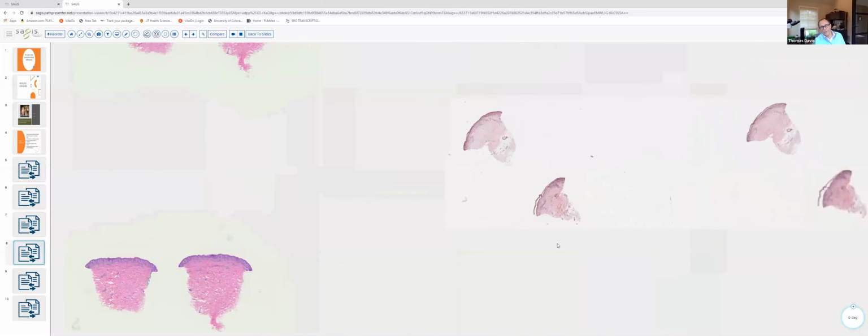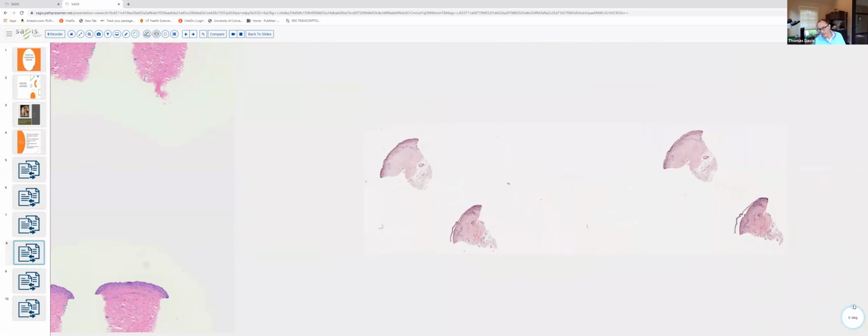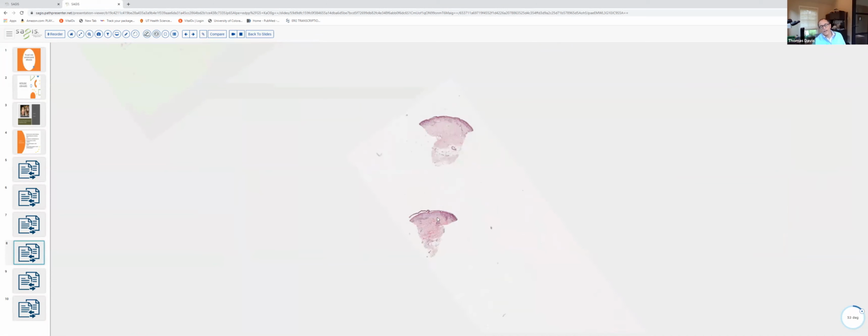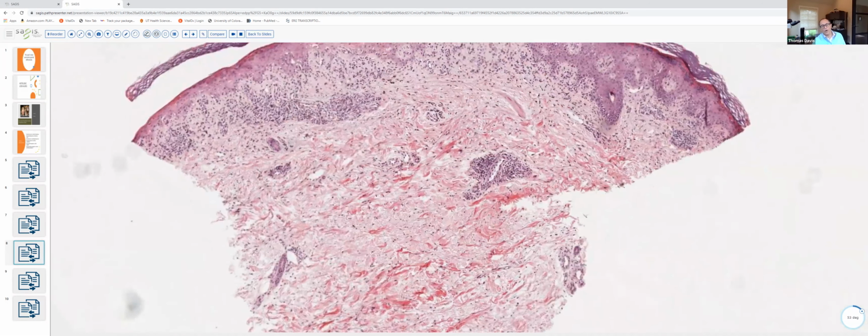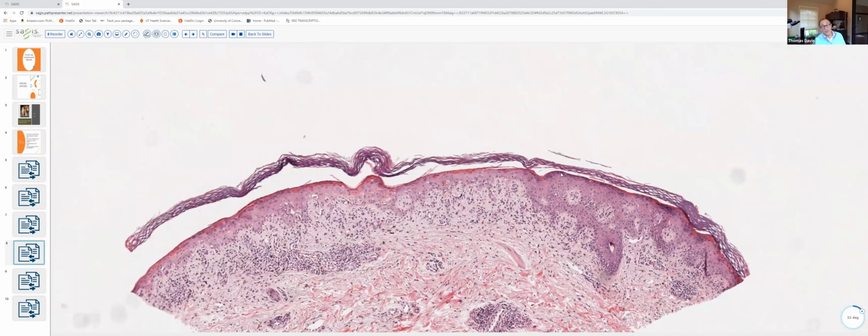Well, how does that compare with erythema multiforme? I'm going to flip the slide here. Here we've got a bisected punch biopsy. This is a much paler slide, but one of the histologic hallmarks of erythema multiforme is a basket weave cornified layer. So if you see an interface dermatitis with a basket weave cornified layer, EM is always in the differential diagnosis. In late EM, one can occasionally see a little bit of parakeratosis, but usually by that point, the epidermis is almost completely necrotic.